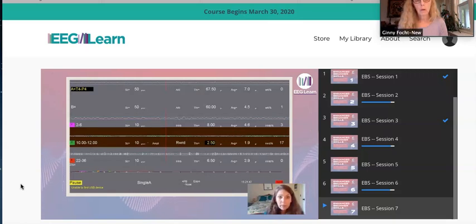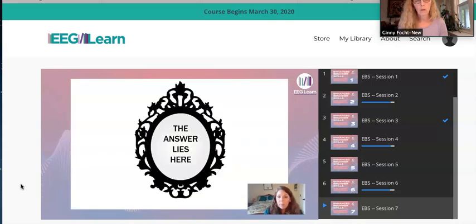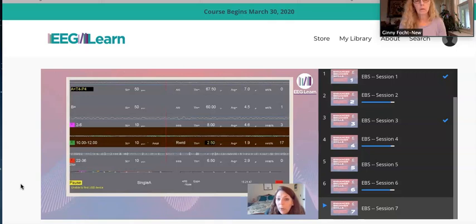It's probably pretty obvious by now, but in a way, this therapist screen is letting the person's brain look in the mirror and see how things are going. If you're not getting a beep, we want to help the person understand what's getting in the way of them practicing whichever EEG yoga posture we're working on.